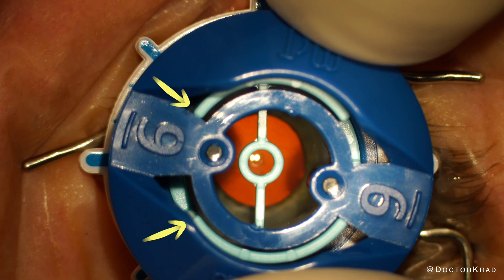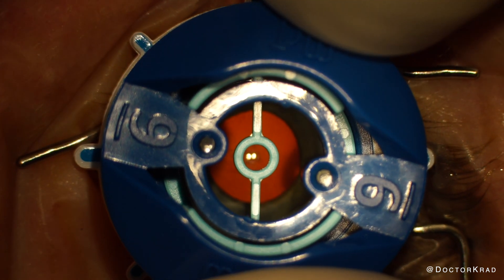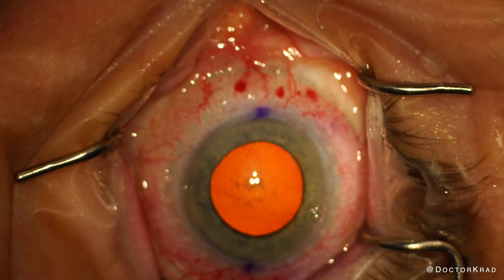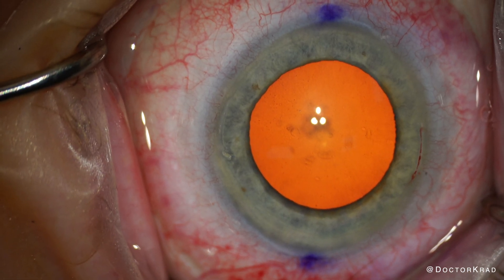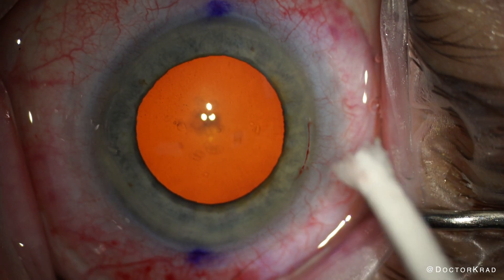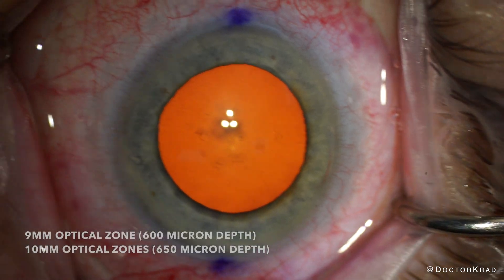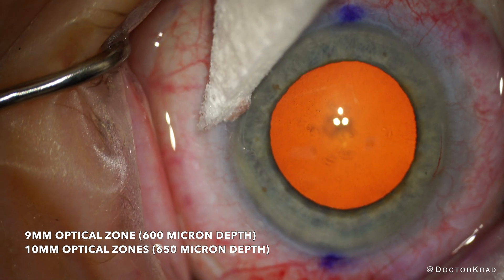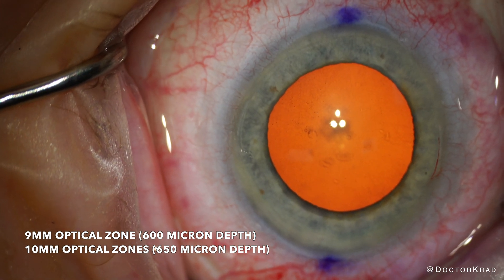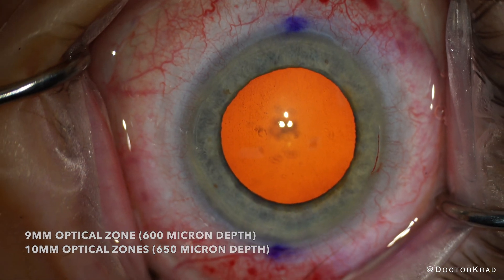I place the blade in the guide, starting all the way on one side of the template, and then rotate to the other side, release suction, and you're done. Here I have two really beautiful curved arcuates at the 9mm zone. They certainly look better than a traditional manual LRI. This 9mm optical zone blade cuts at a 600 micron depth.